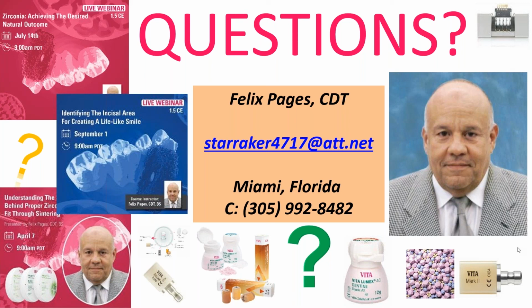The tissue is translucent. And so if you're going to do that, you need to set up a condition where you have freestanding tissue porcelain, which will look a lot better. You can't just, look, if you put any stain on top of an A3 and try to make it look like gum, it's not going to look like gum.